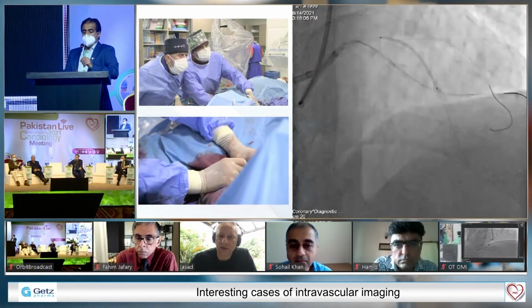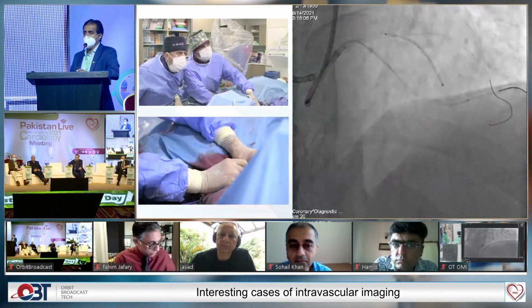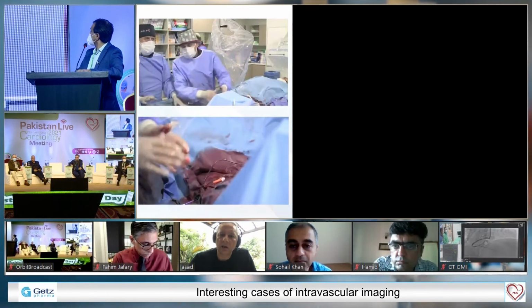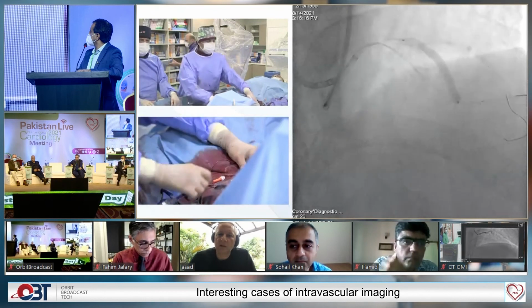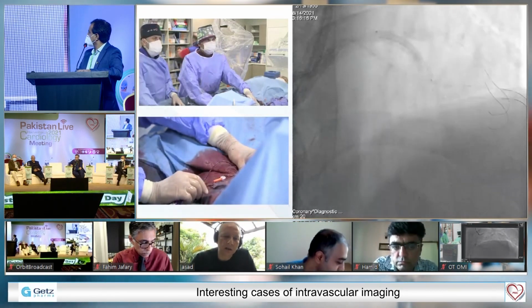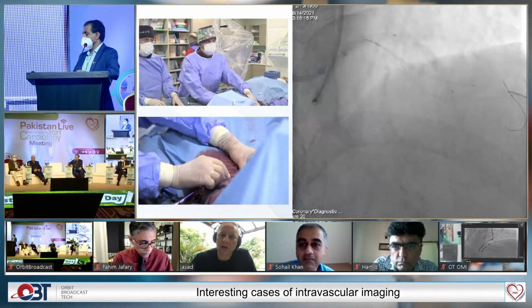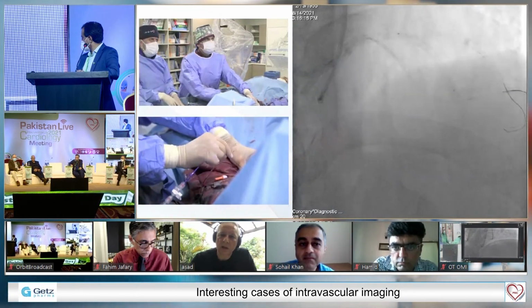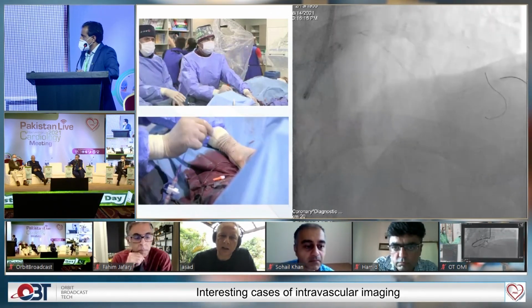Does that answer? And what about the choice of microcatheter? Because sometimes microcatheters don't cross, and you have to use various support devices or even Guidezilla to get it through. So what choice of microcatheters would, in your personal preference, or any of the other operators here, Fahim or Sohail Khan? I mean, what choice of microcatheters do you have?